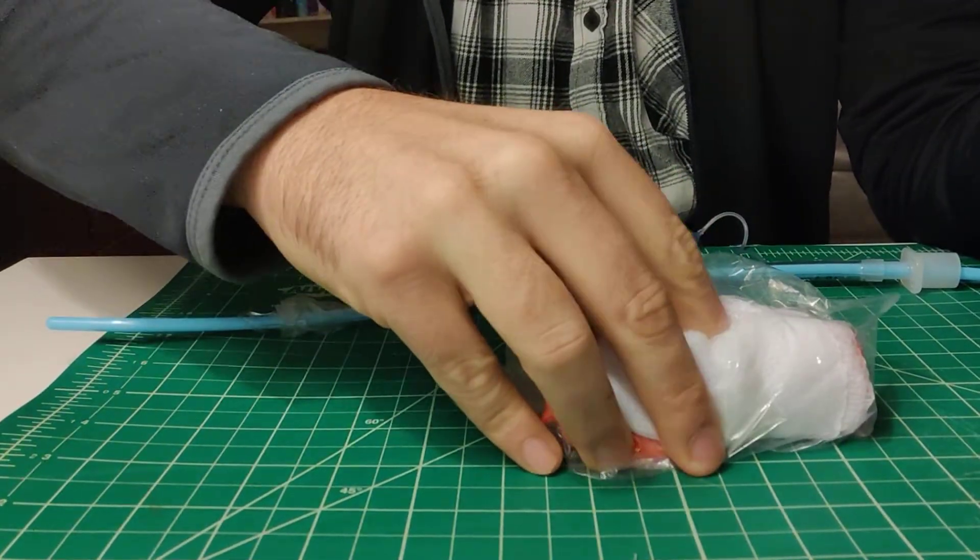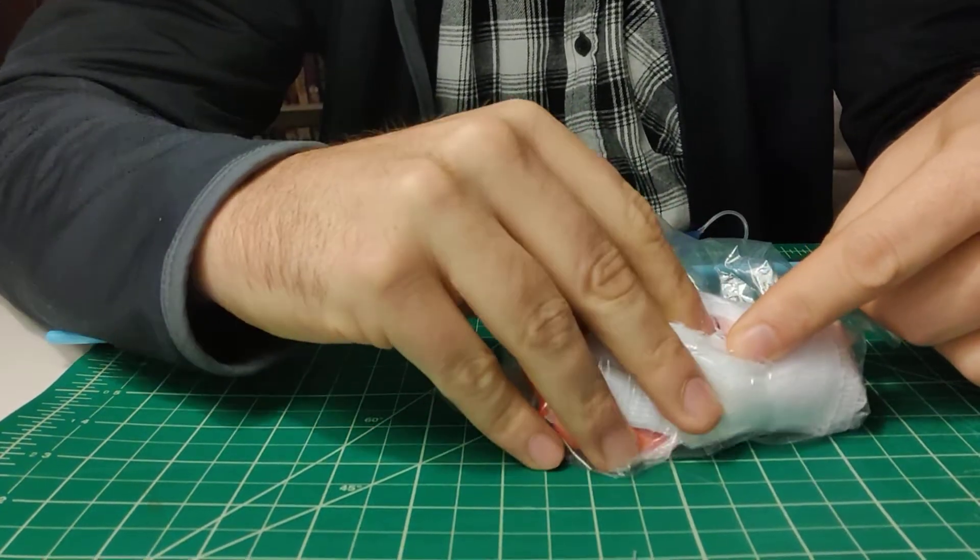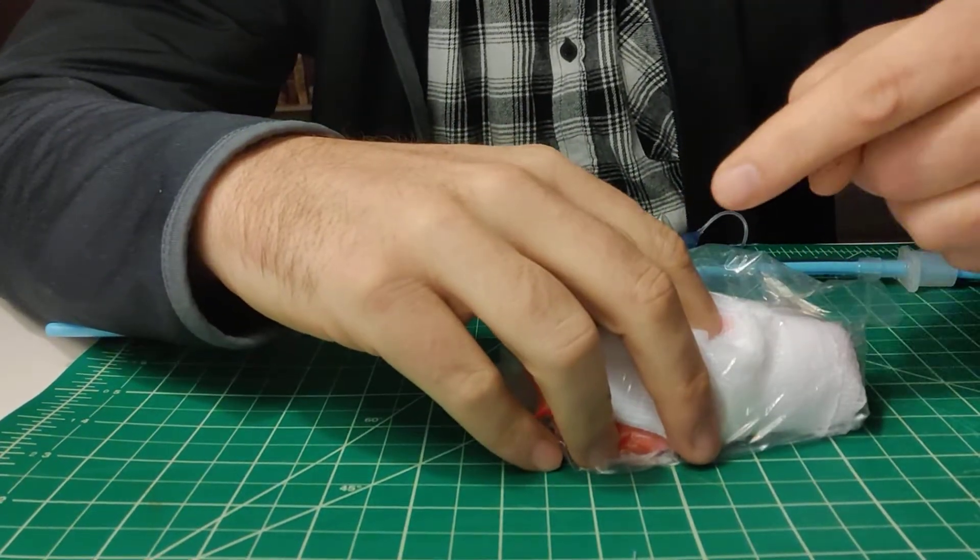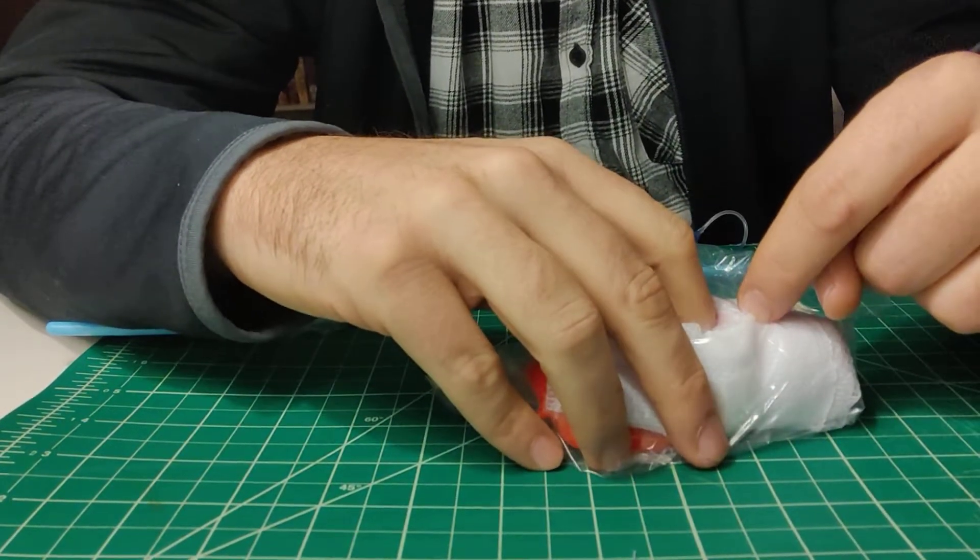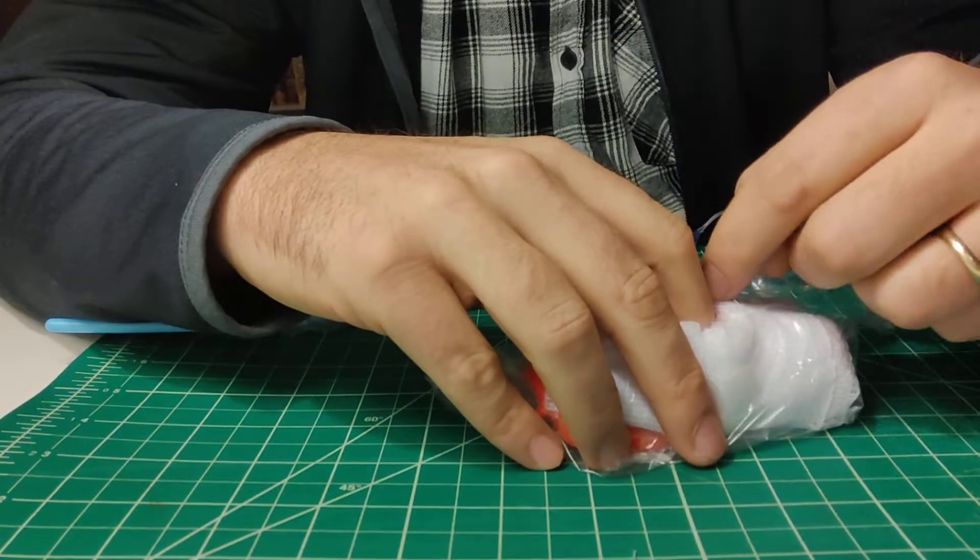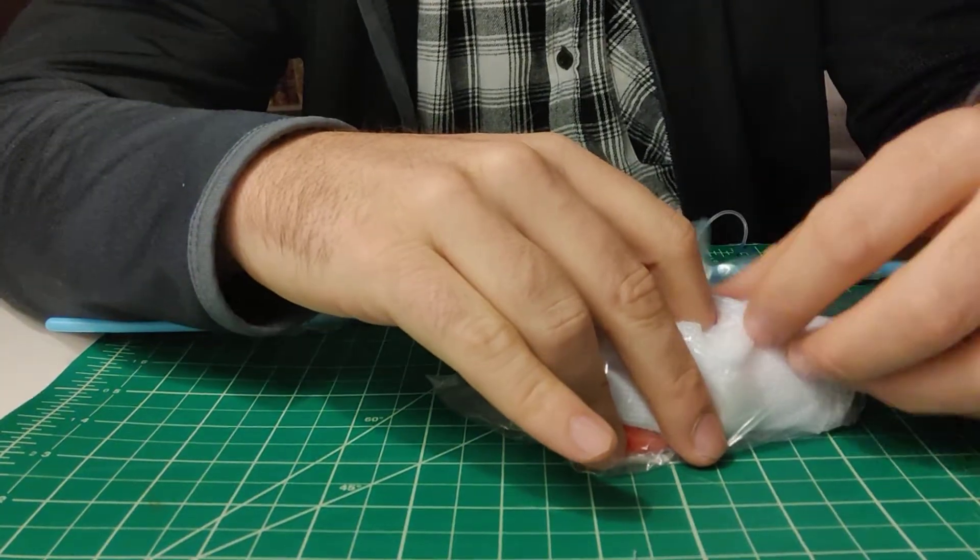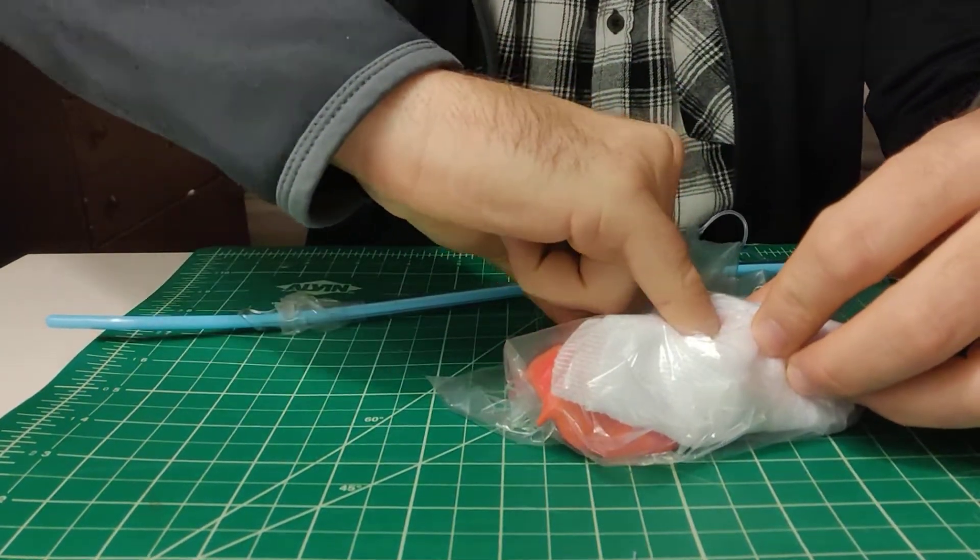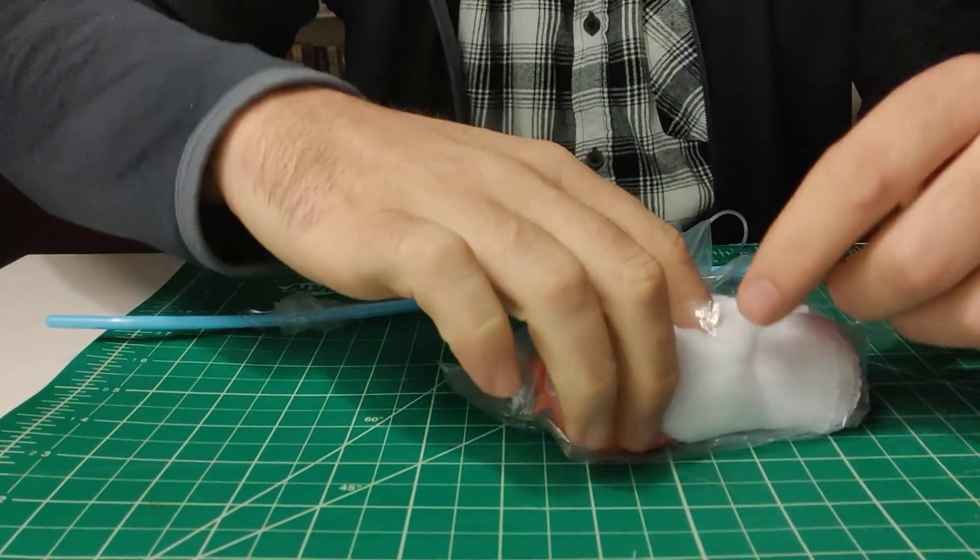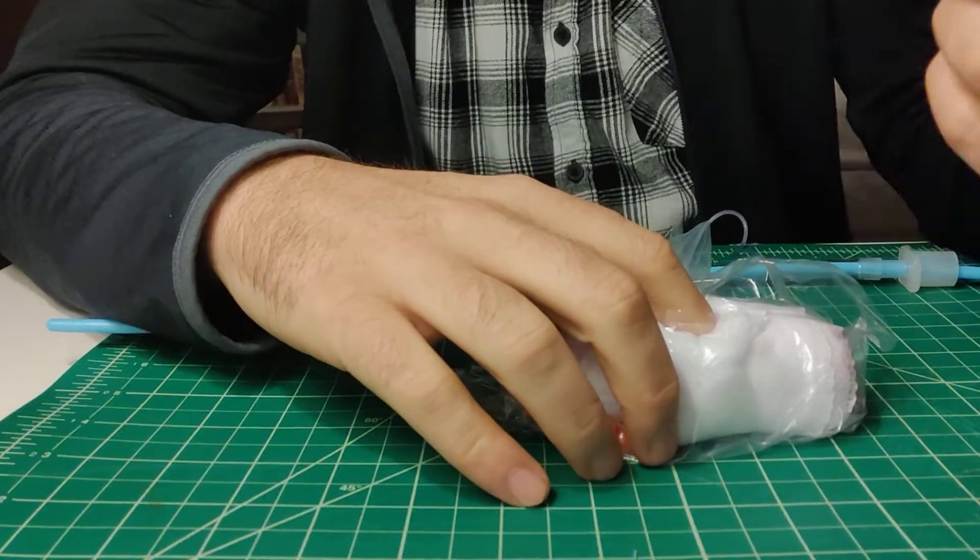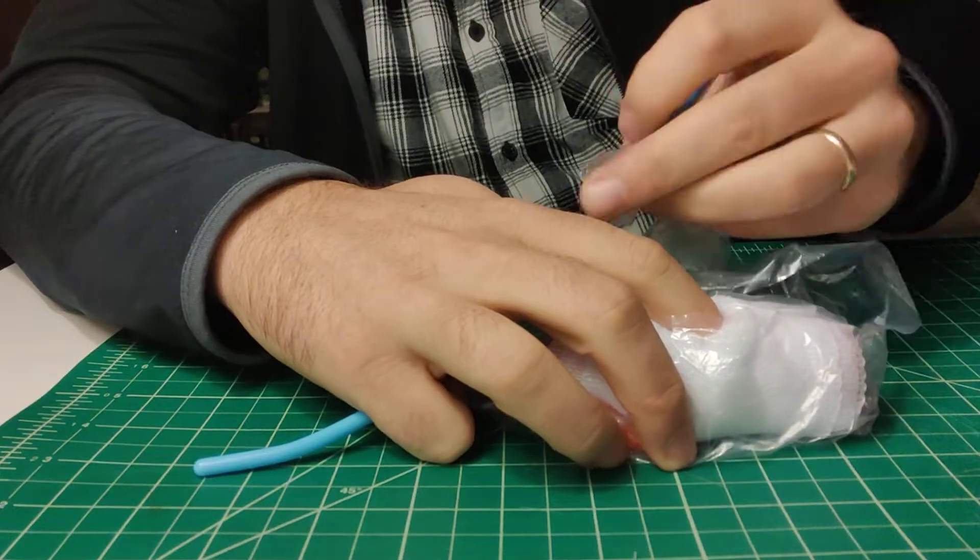And at this stage, you might have to, this is another aggressive point and real people, you have to push through tissue and all kinds of other stuff. Sometimes your goal is to put your finger to the floor or the posterior wall of the trachea. If you can't do that, it could like your finger's too big or something. You can either enlarge your incision if you were not aggressive enough, or if it's just your finger is too big, you can use your pinky or something like that too. That's totally acceptable. But your finger should go to the posterior wall of the trachea.